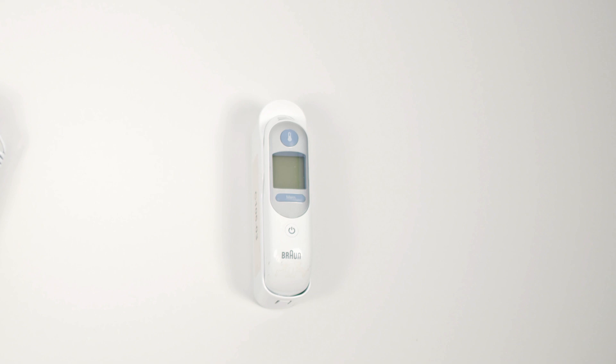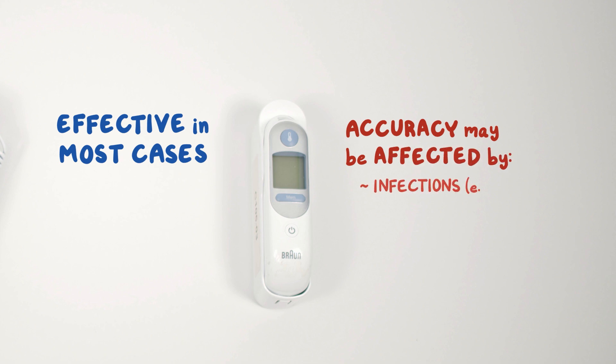Tympanic membrane temperature procedure. The tympanic membrane thermometer, or TMT, measures infrared emissions from Fred's eardrum. It's effective in most cases, but accuracy may be affected by infections like otitis media or cerumen.